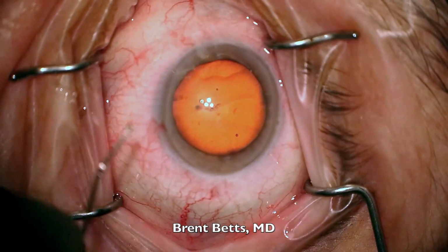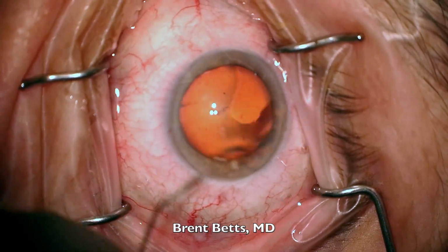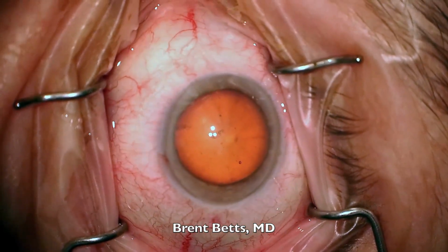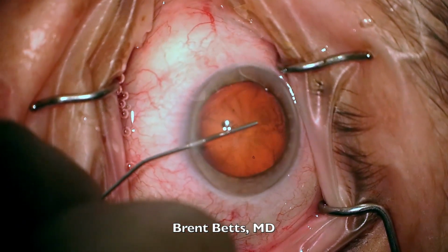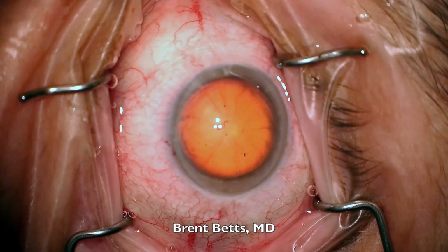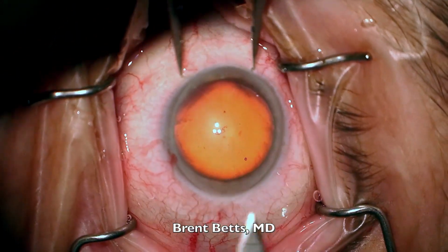Periodically, you'll notice that we wet the cornea to keep the view of the cataract clear. I inject the eye with preservative-free lidocaine and phenylephrine to help with anesthesia and keep the iris dilated. Next, I inject a viscous substance, which we call viscoelastic, into the anterior chamber of the eye. This fills up the anterior chamber and protects the cornea and iris from any trauma during the surgery.